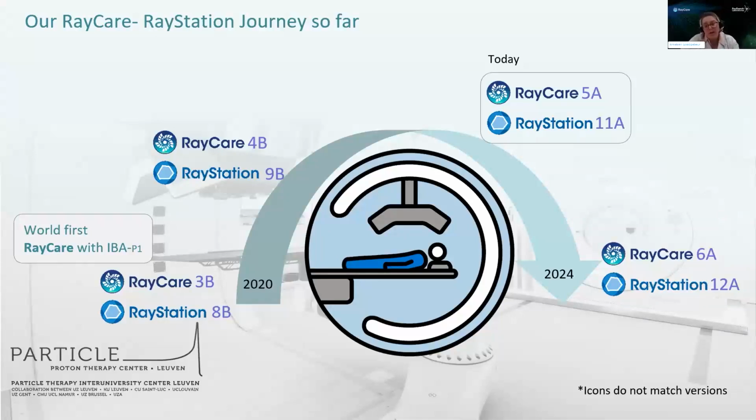I already want to note that upgrading does result in really high workloads on the MPE and quality manager for us, so the workload-wise to perform all of those validations each time. But once we've upgraded, we have both the newest RayCare and RayStation package.